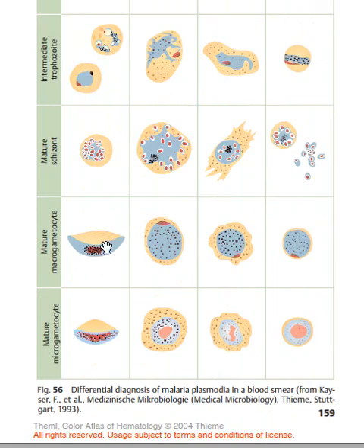This is the macrogametocyte. Sorry, I made an error.